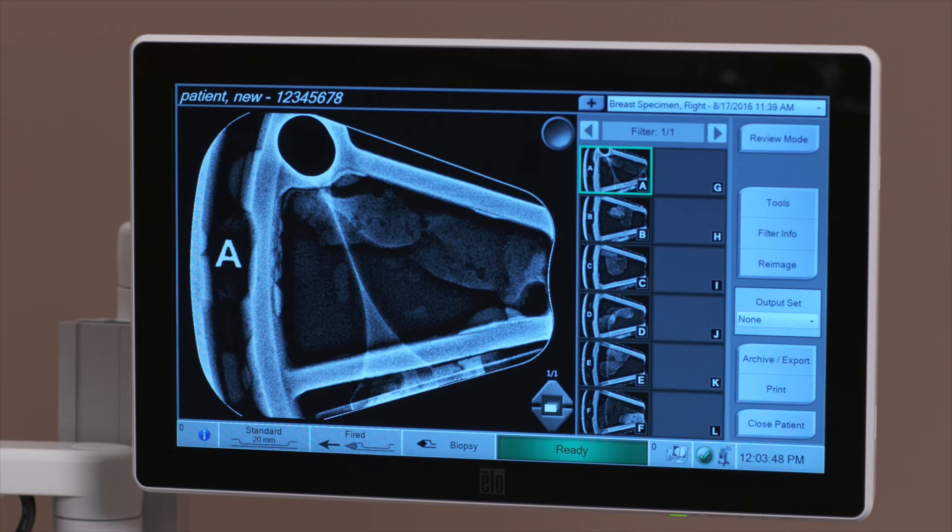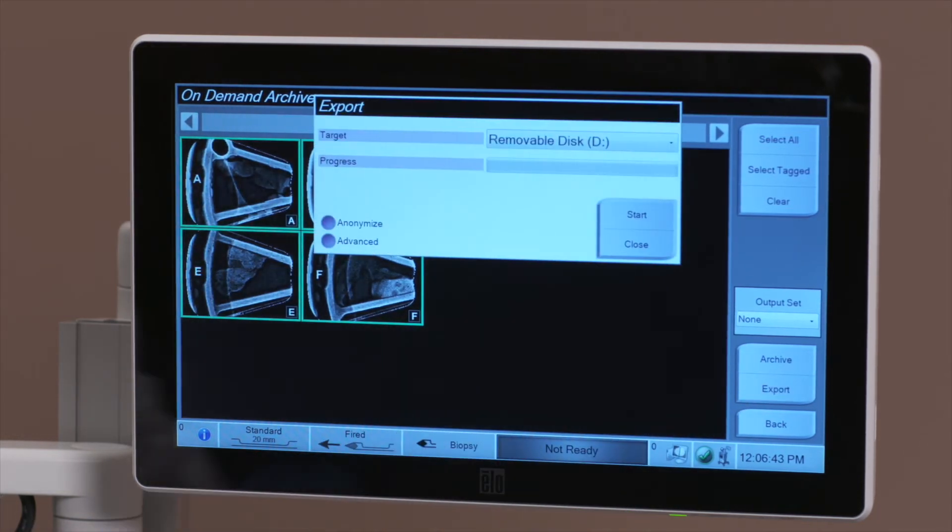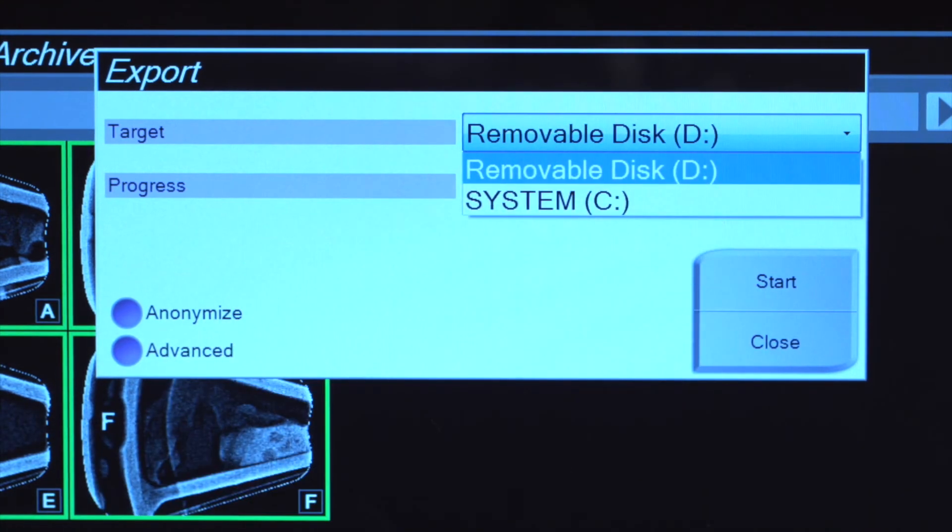Selecting the archive button will send data to a PACS device. Selecting the export button will send data to a mapped drive such as a local hard drive, a USB device connected to the console, or a network drive.